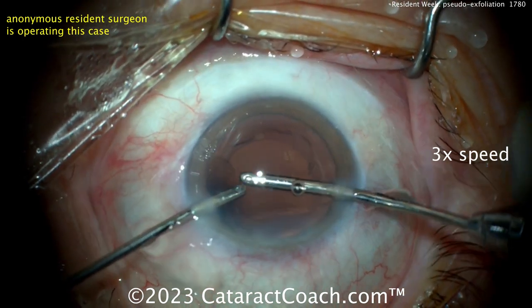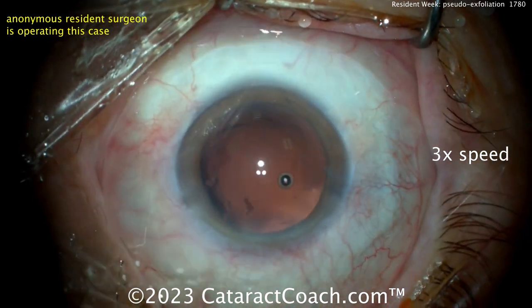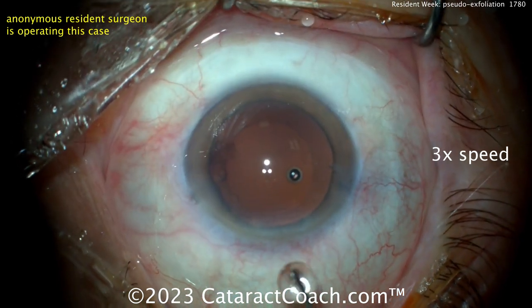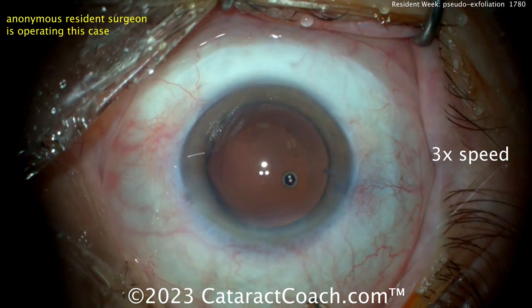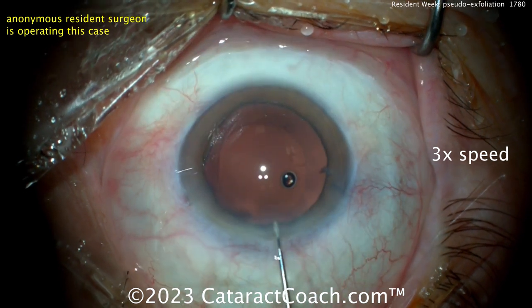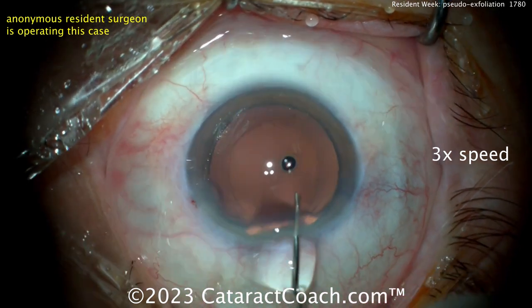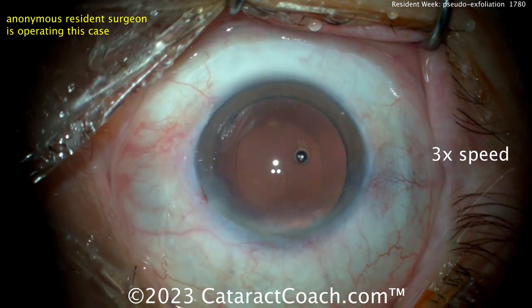The nice part with bimanual I/A is that yes, you need an extra incision, but you do have a lot easier access to the full 360 degrees of the capsular bag, and you can switch hands pretty easily. Now putting viscoelastic in, filling up the capsular bag — some BSS or possibly more viscoelastic; it's come out the incision now. Now ready for the lens.